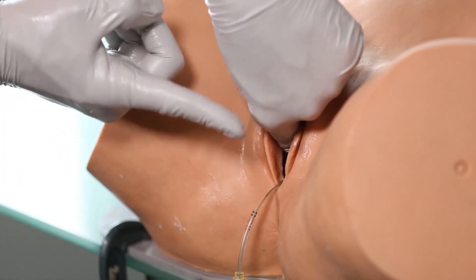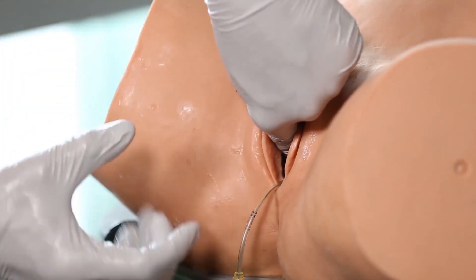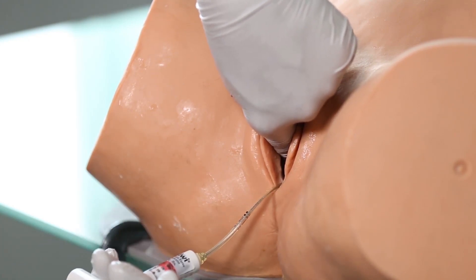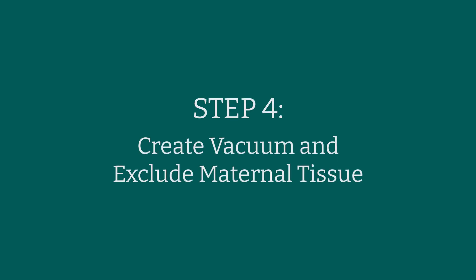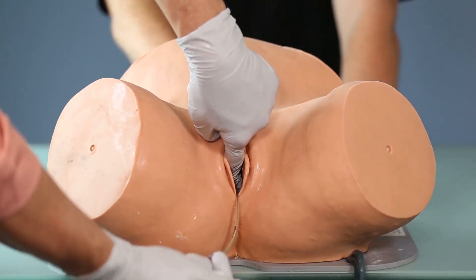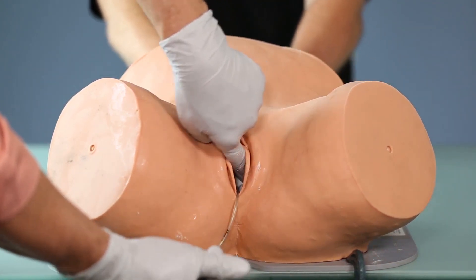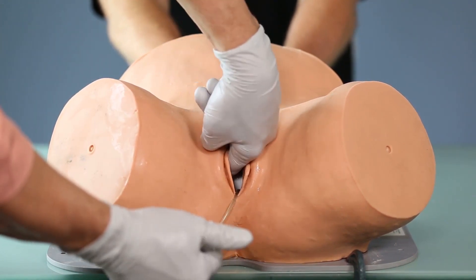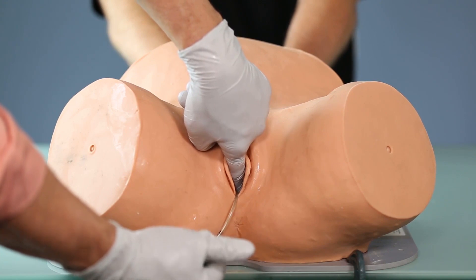I hold and stabilize the cup with my superior hand and use my other hand to establish vacuum. Step number four is to establish vacuum and also exclude any maternal tissue that may be trapped underneath the cup as vacuum is applied.